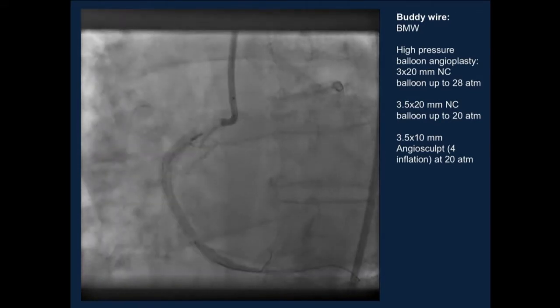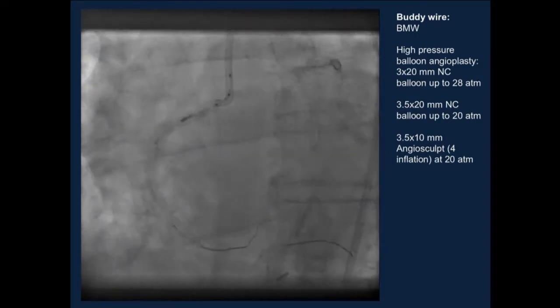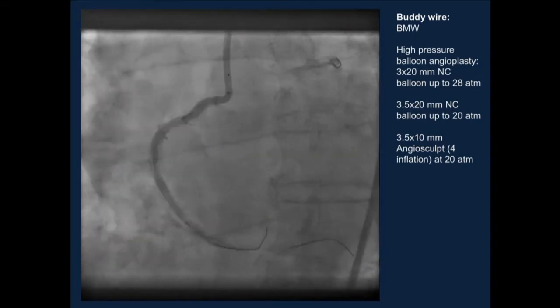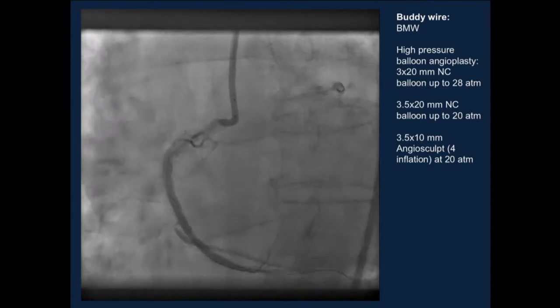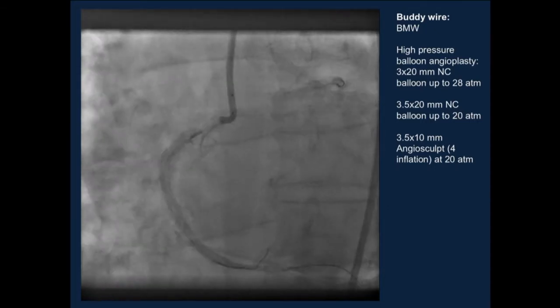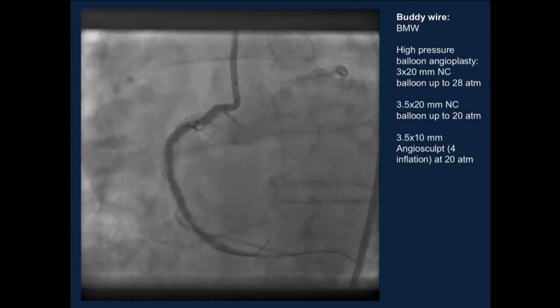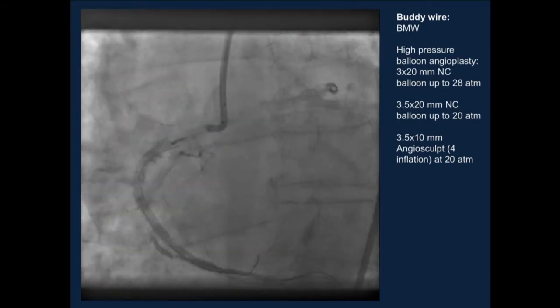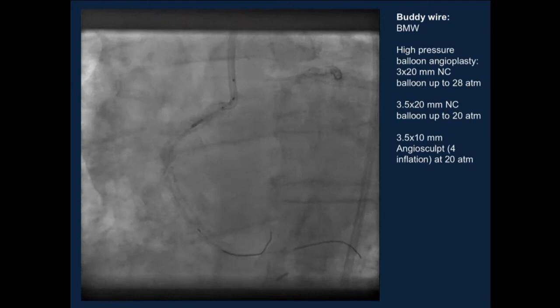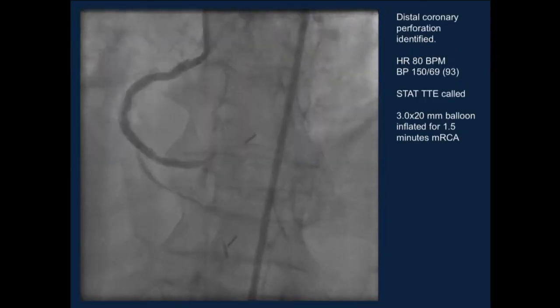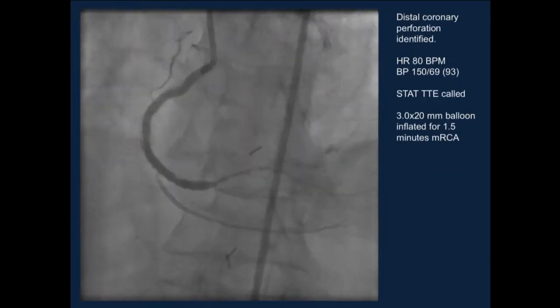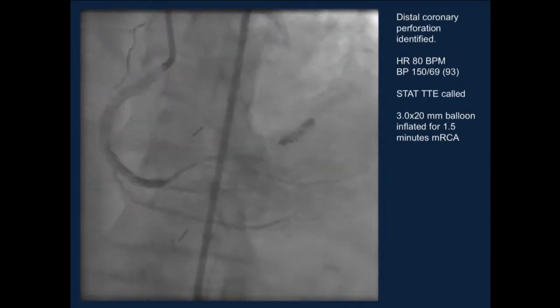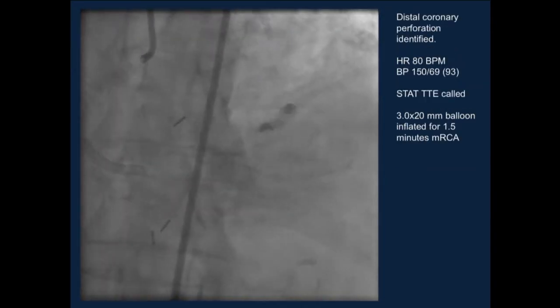Things are looking a little bit better at this point. We still have the buddy wire in place — a BMW — along with the run-through wire. We were somewhat happy with the direction this was taking, but at some point in between we noticed there was a stain distally, so we took a picture, and this is what we see.